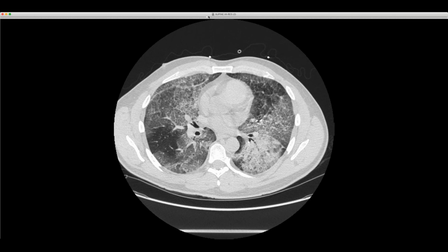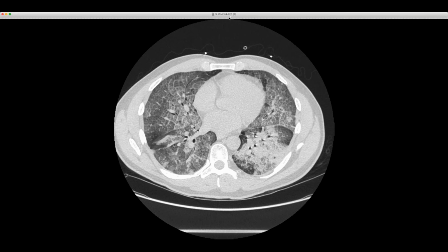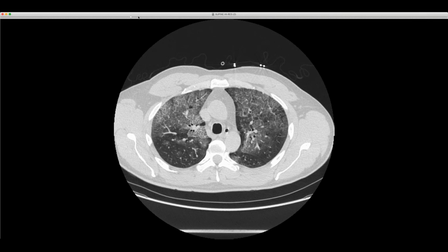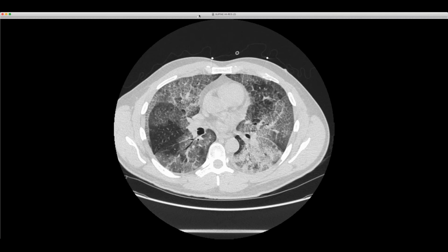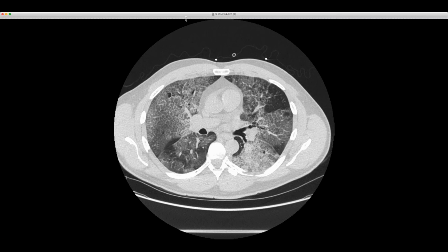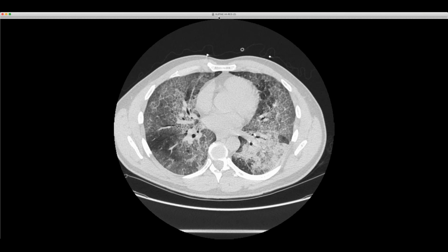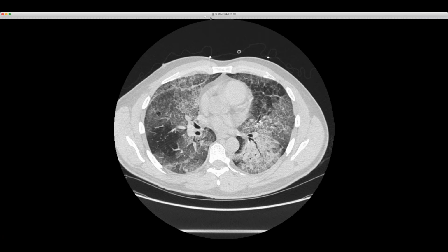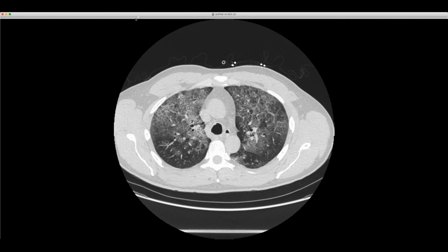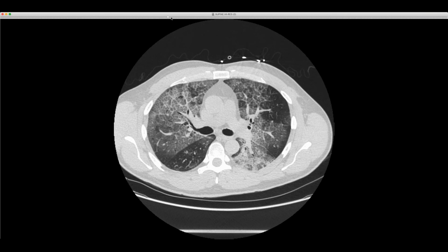So he was exposed to aluminum dust, and presumably this is one of the rare but reported cases of aluminum dust inhalation causing alveolar proteinosis. He went on to have a whole lung lavage, and this got much better. I don't have a follow-up radiograph, but just imagine a relatively normal radiograph. This is an interesting case of aluminum dust-related alveolar proteinosis.